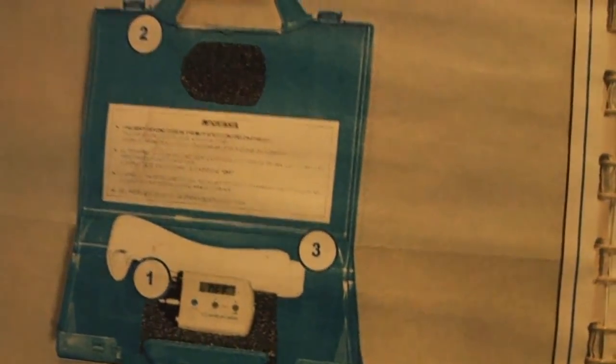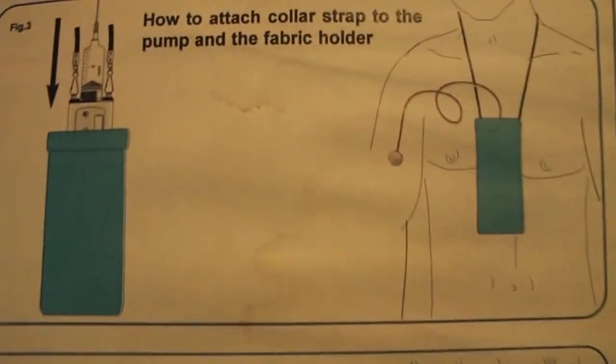Here's the box that I've shown many times in my review — check out the Dextra injection pump review video if you haven't already. There's also a leather pouch, though I don't think that comes included with it.